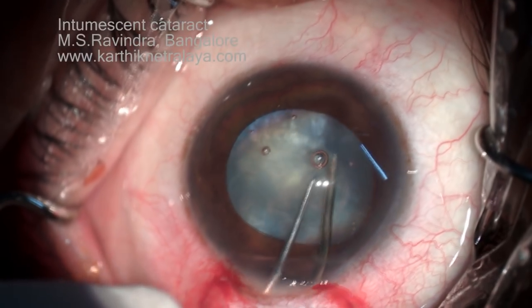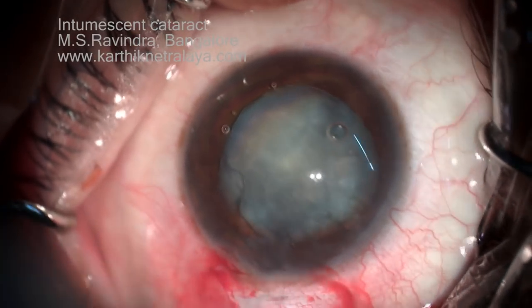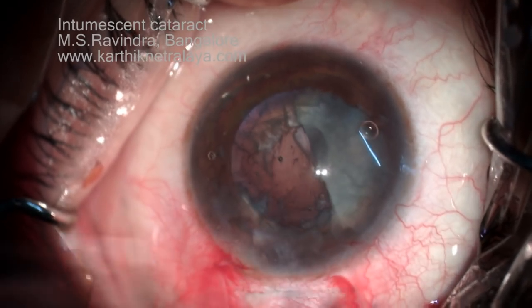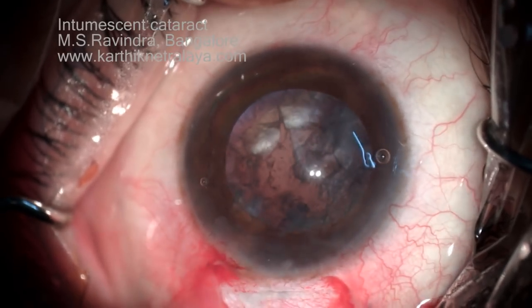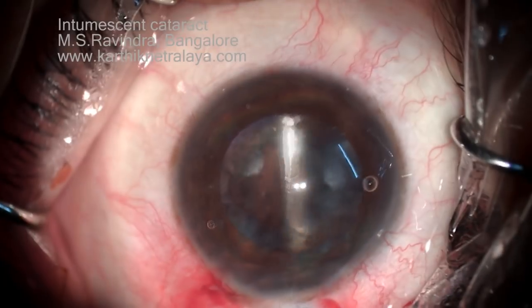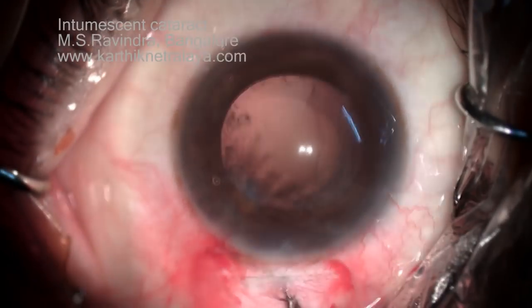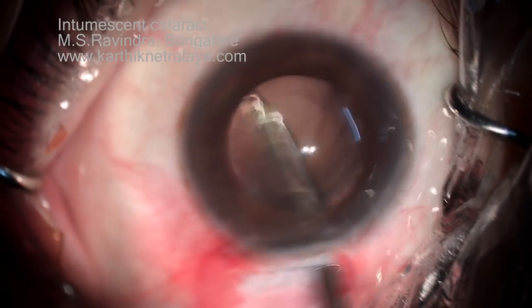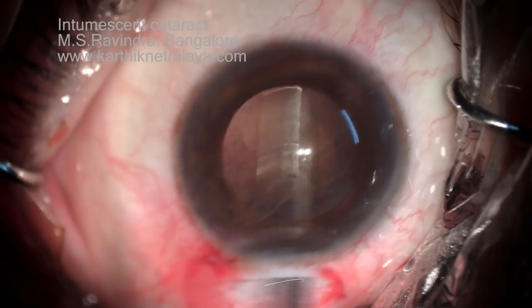Always keep imagining the zonules at every point in these advanced cases, because the zonules will be quite lax and it is easy to tear them, causing prolapse of the equator. The nucleus is easily bisectable. The nucleus is taken out without putting any stretch on the tunnel. Cortical aspiration is important — go to every clock hour in the capsular bag at the equatorial area and remove chunks of cortex. The cortex will have lost its architecture; it does not have thread-like or continuous architecture but is in clumps. Remove at every clock hour to avoid a surprise cortical appearance post-operatively in the anterior chamber.